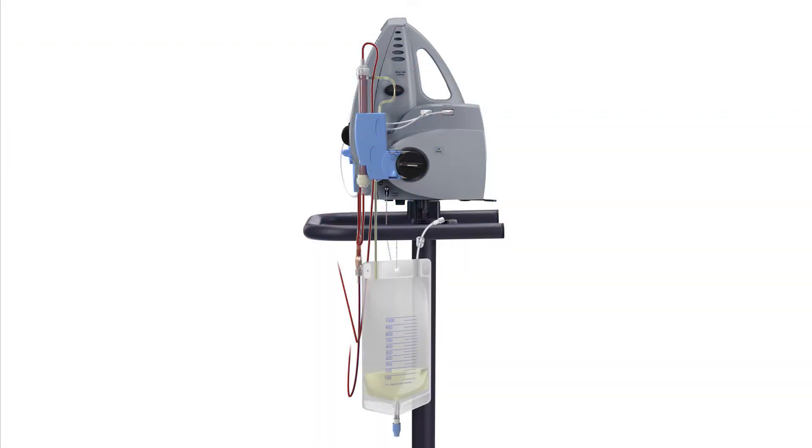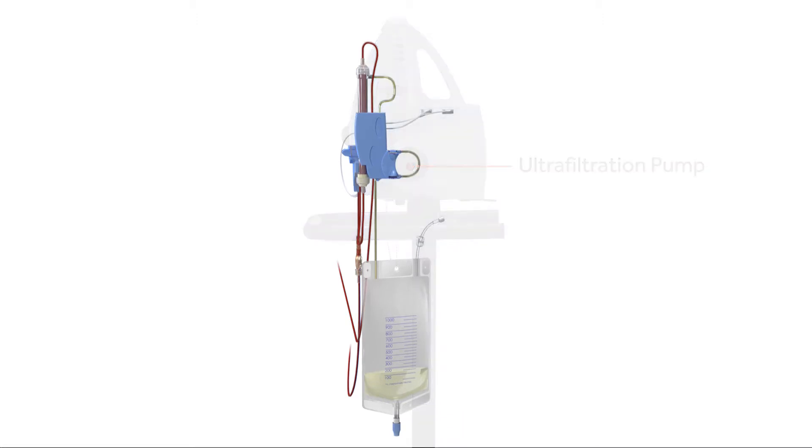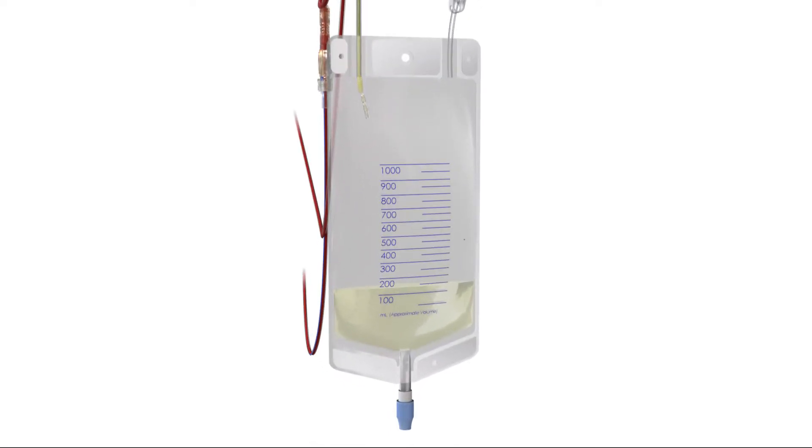As blood moves through the filter, the ultrafiltration pump begins to withdraw fluid using negative pressure to draw the fluid across the filter membrane. The removed fluid collects in the ultrafiltration bag.